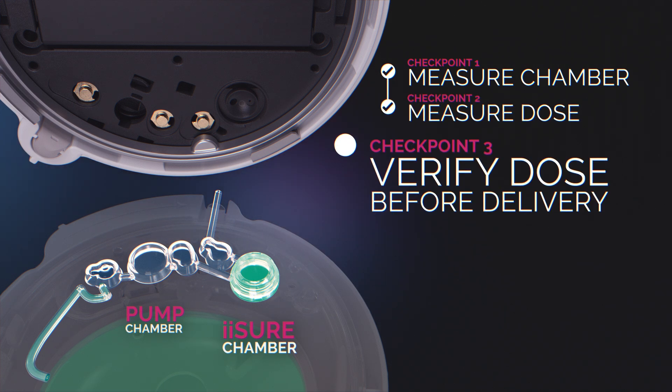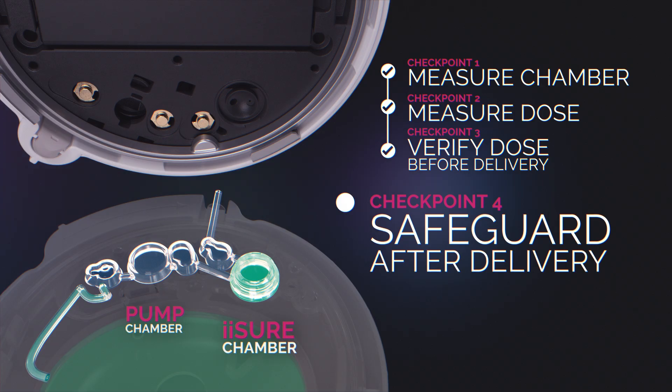After a slight pause, the iSure sensor takes another measurement to confirm the amount of insulin in the iSure chamber. Once the volume is confirmed, the iSure chamber delivers the insulin dose to the user.